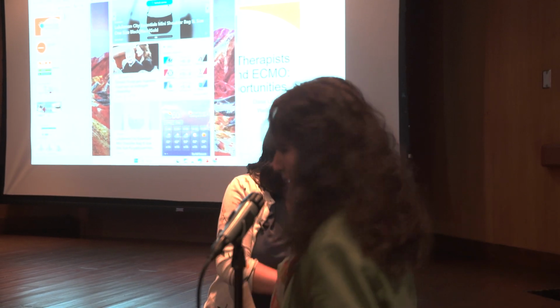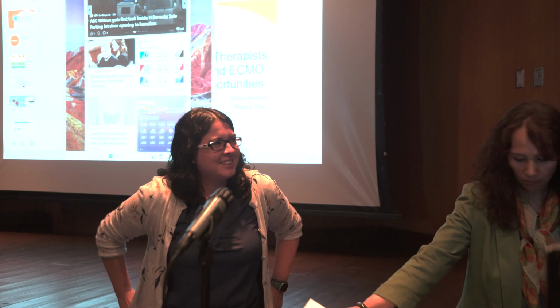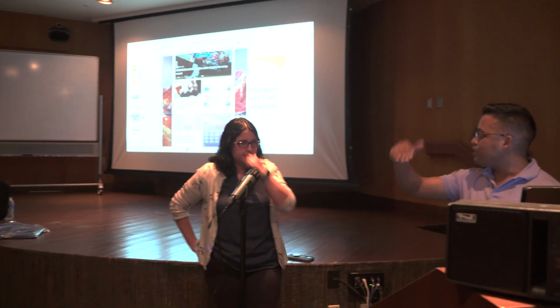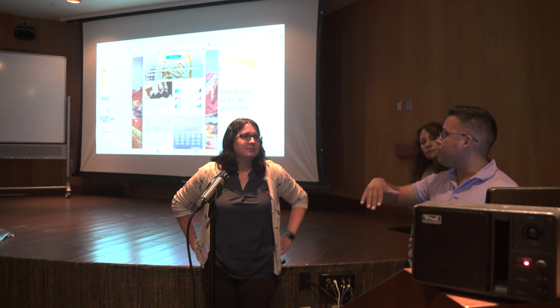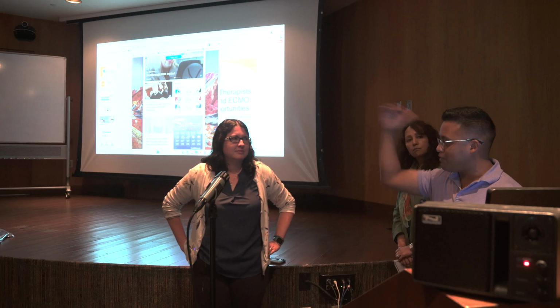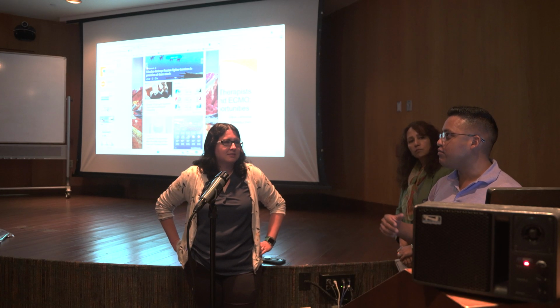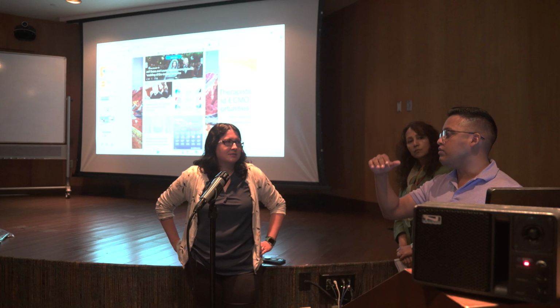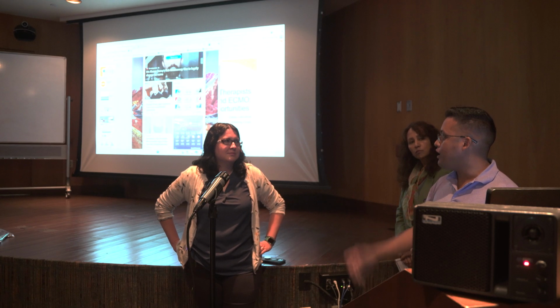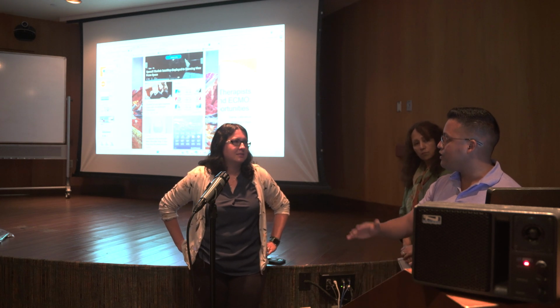So, I think in school, and what we've been taught is compliance, right? If I increase PEEP and I see the compliance go up, I'm trying to find the most optimal compliance. But it's really interesting what we see is that even though compliance might increase by 10 points, it is probably hyperinflating the lungs. Or even vice versa. Right?